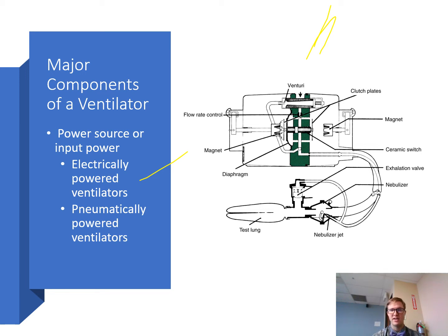off of that, right? So they've been used to administer what was called IPPB treatments, or intermittent positive pressure breathing treatments, and they helped with volume expansion and delivering medication to those patients. So when we've seen those, they were widely used for not only breathing treatments, but even for mechanical ventilation.